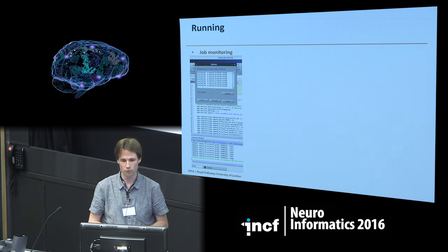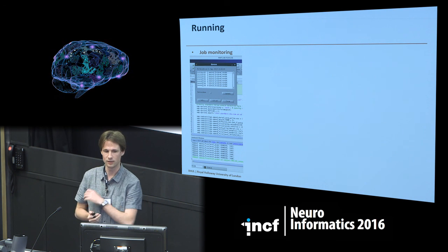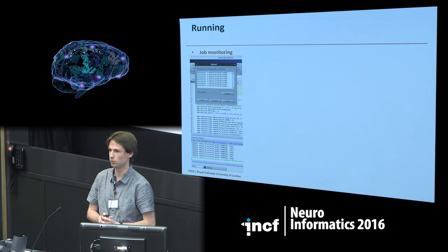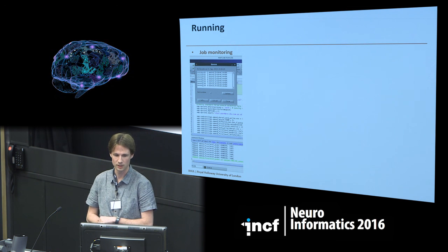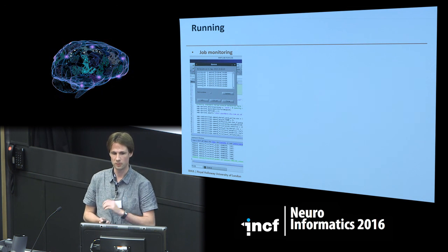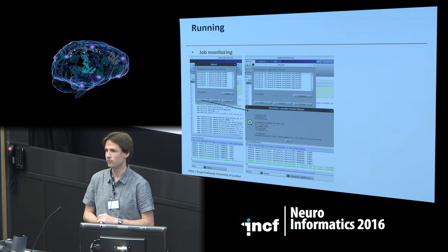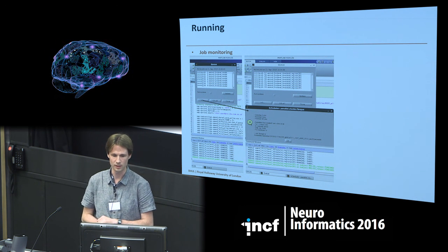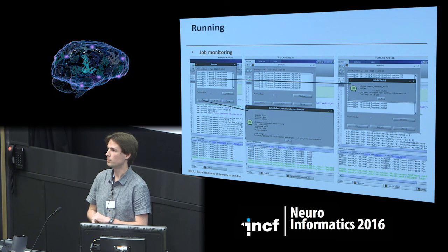For cluster execution, AA allows you to monitor all the jobs. There are nice GUIs which show all the jobs actually running, and it also gives information about the cluster you are using and the independent jobs.